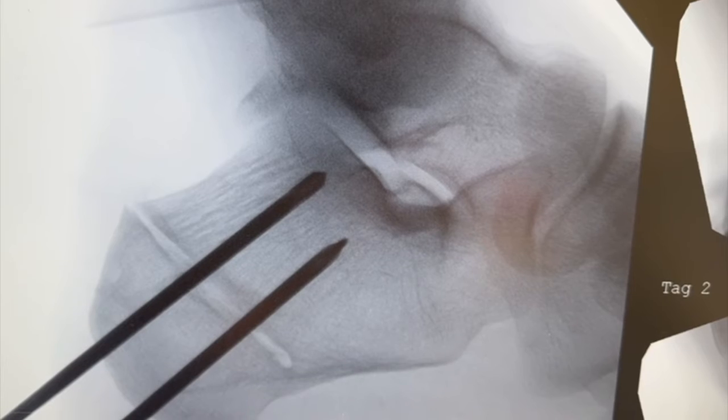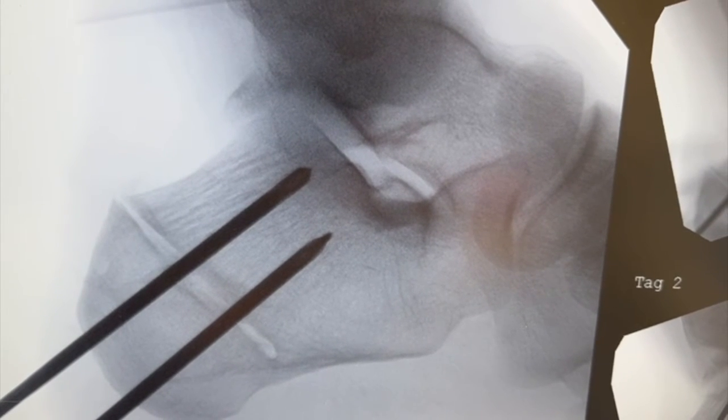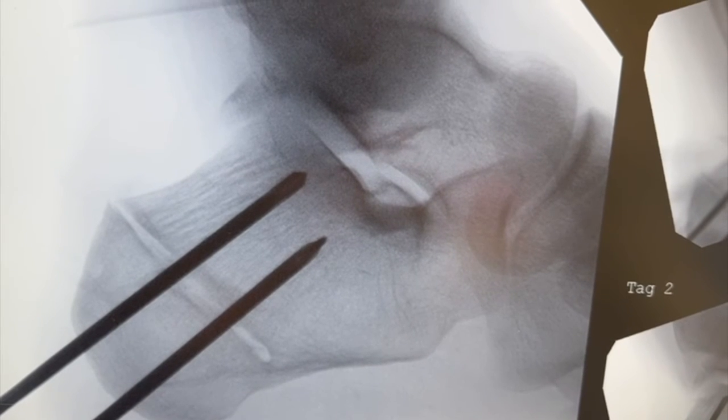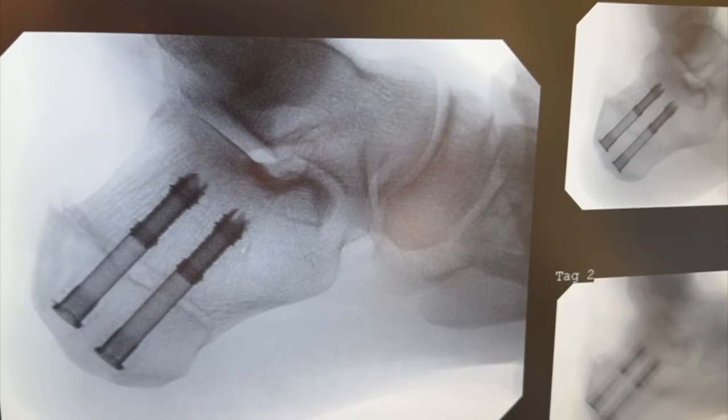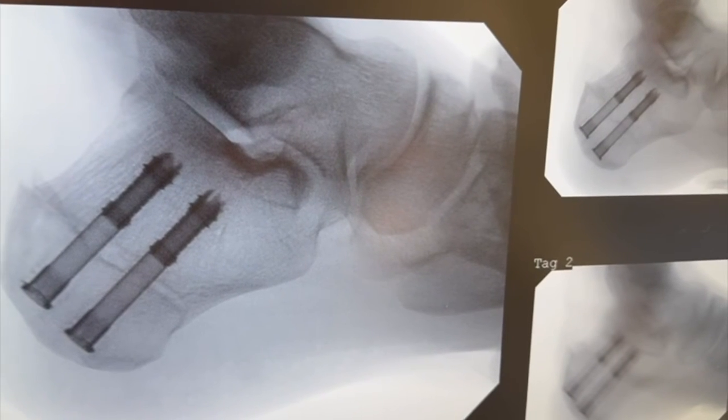We've now got the guide wires for our two 7 millimeter cannulated screws, and these both angle up toward the subchondral bone at the posterior facet of the subtalar joint. This is our final fixation with two cannulated screws. You can see nice closure of the osteotomy.